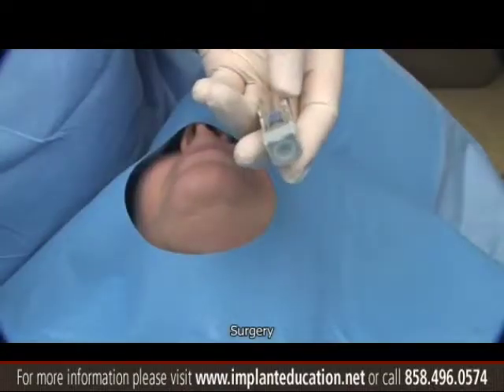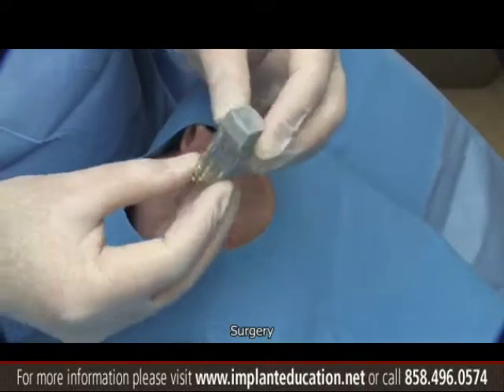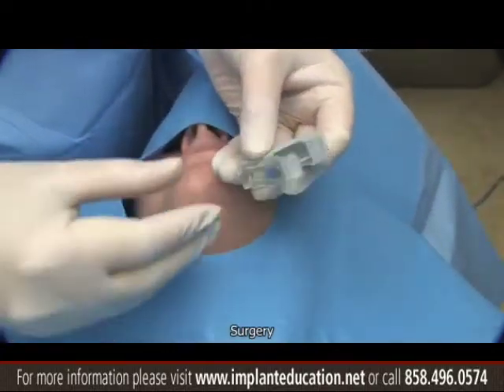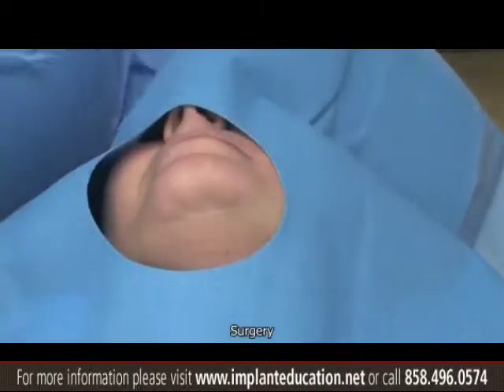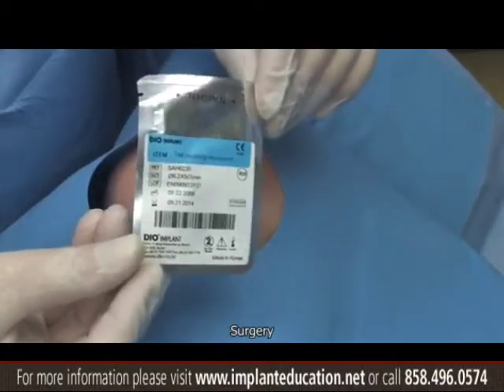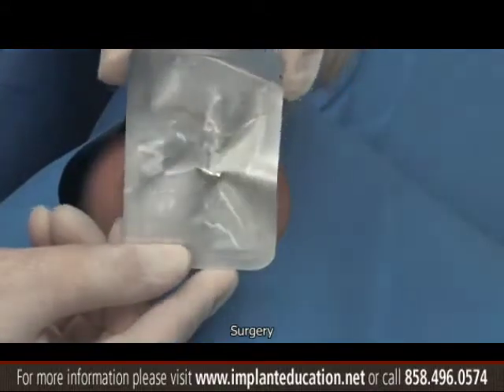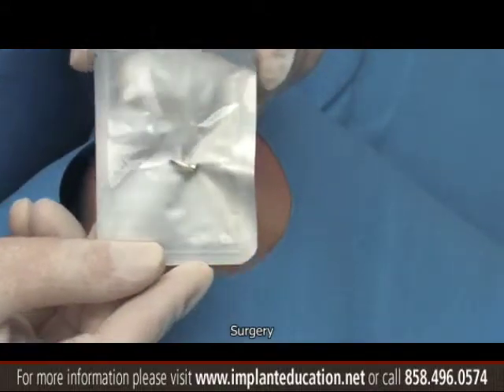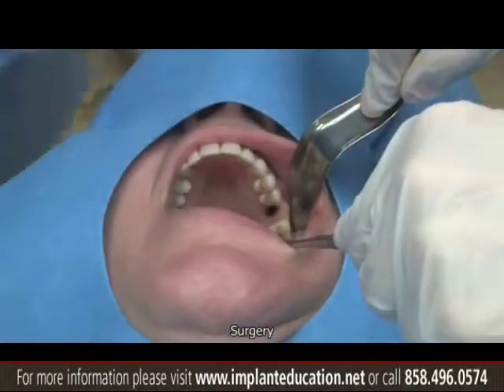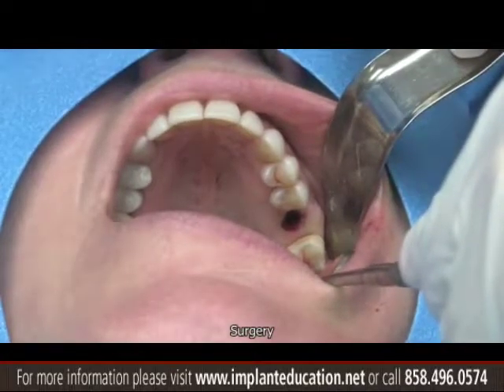This is the packaging of the implant. If we get good initial stability, we will be able to place the healing abutment — this is a 3mm high, wide body healing abutment. Otherwise we can place the cover screw.